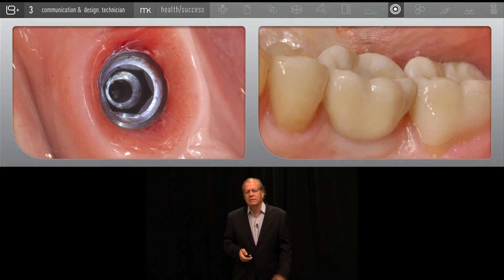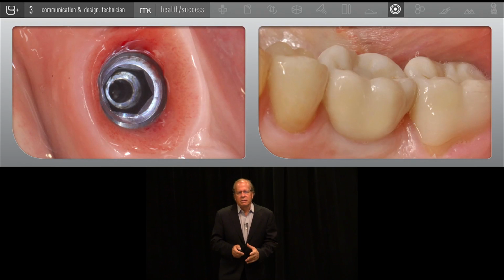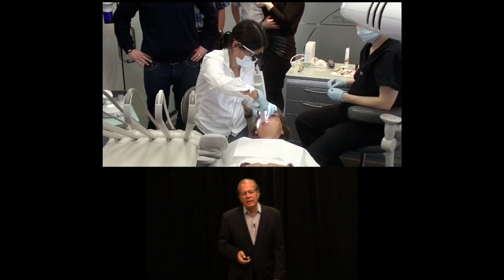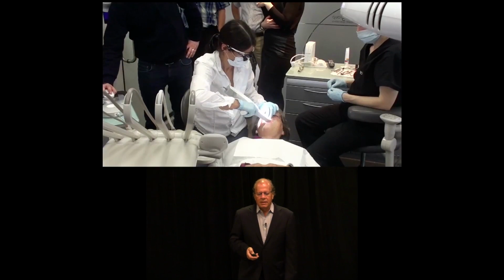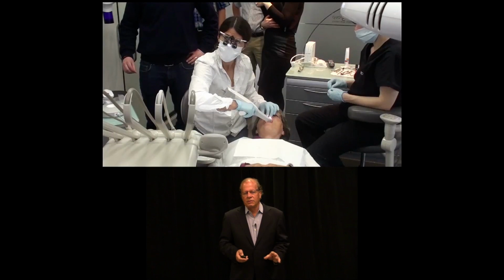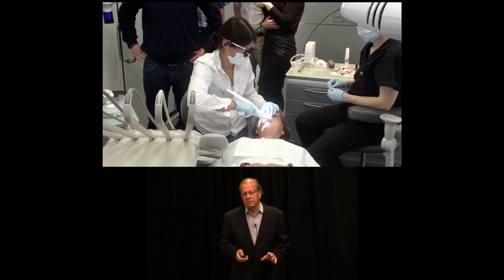So this is one of the cases. We removed a molar. You can see the subgingival prosthetic envelope. It's ideal, healthy tissues. And you can see the crown that I actually removed. So we're going to work on that site. And I'll say this, for those of you who know Sonia and myself, your auxiliaries can actually do all the scanning and do most of the work for you. And don't take it lightly.